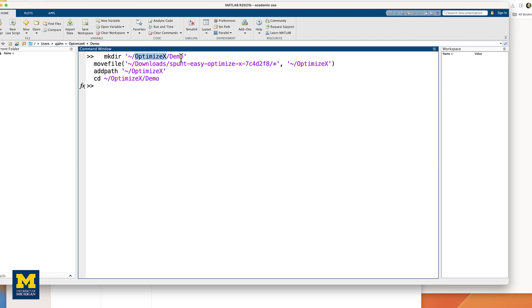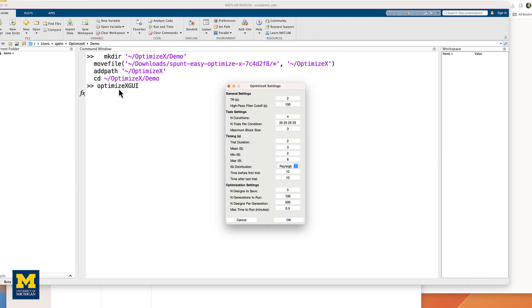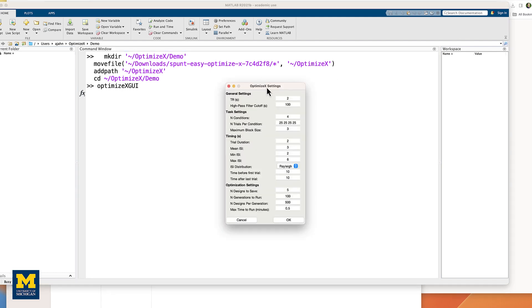This will create the folders OptimizeX and the subfolder Demo in your home directory. The scripts to run OptimizeX will be placed in the OptimizeX folder, and we have the subdirectory into which we can write our example timing schedules. We then add the path, and then we navigate to this demo directory. If you then type OptimizeX GUI, you should now see the main input dialog.